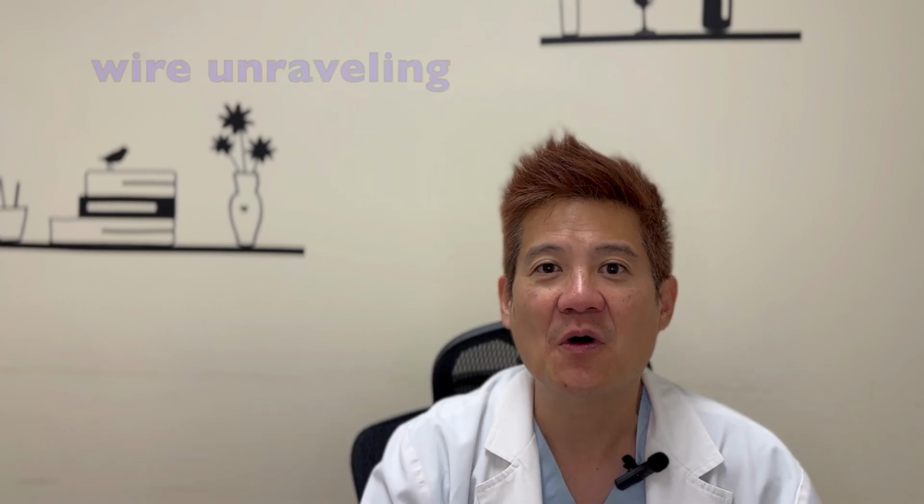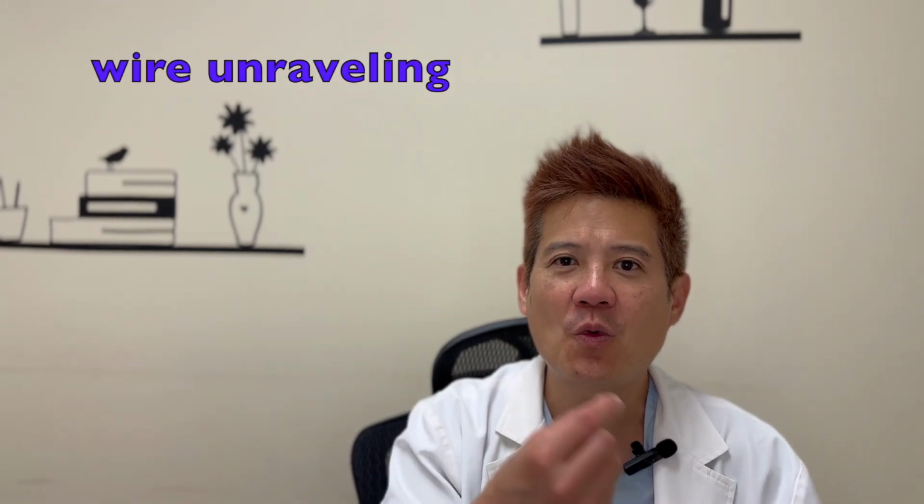However, we need to be careful of wire unraveling, because when a wire unravels, instead of just a clean fracture tip, what we have is a long unravel, very thin and often difficult to see shred that comes off the wire, and it can go up into the aorta. And this can cause left main or aortic thrombosis and strokes. So it's very important to check that there's not wire unraveling. And especially in patients who are a little bit bigger in body habitus, it's sometimes difficult to see even on cine. And so it's best to put some sort of imaging device to check that the ostium of the coronary is clear of an unraveled wire.